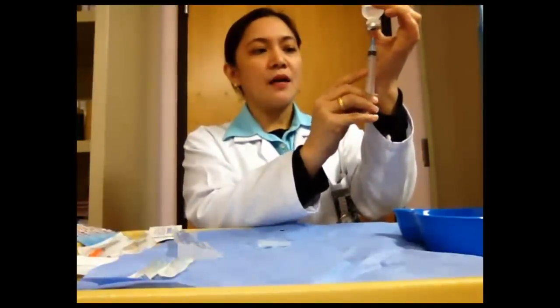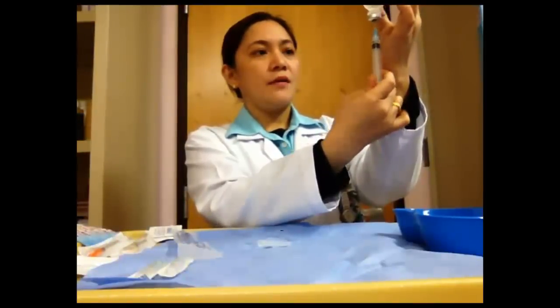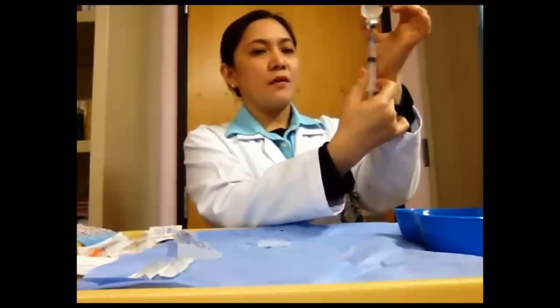Make sure that the calibration of the syringe is facing you so that you can easily read the medication, whether it is already 2 ml. Okay, so we have 2 ml of medication. It should be at your eye level.